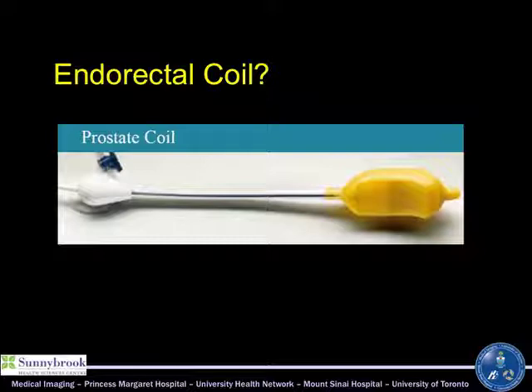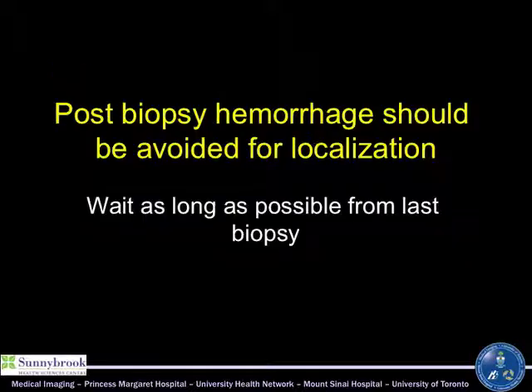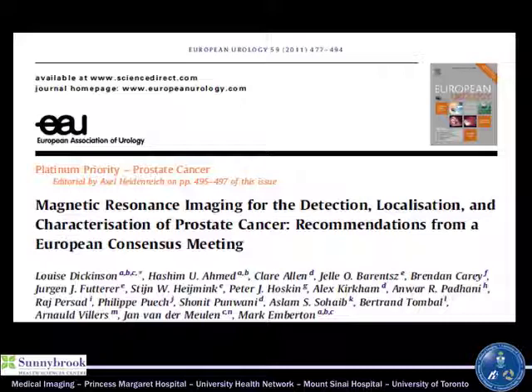But we have used it for years, but we are moving away from it because of the cost and wait list issues now. Post-biopsy hemorrhage is an issue for MR interpretation, although the publications are varied on this. I will tell you, I'm convinced it's an issue. We like to wait as long as possible from the last biopsy. So the wait list in this scenario, where it's assessment after a recent negative biopsy, is not a bad thing. 8 to 12 weeks I like to wait. It still causes problems even that far out, but the longer the wait, the better in that scenario.